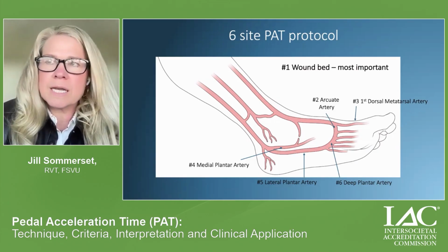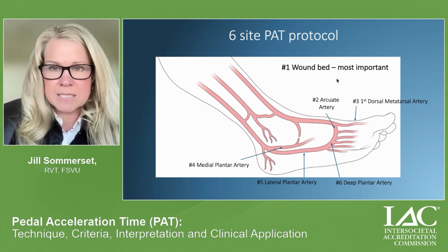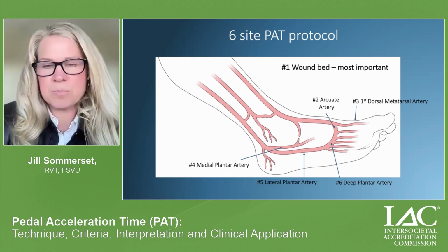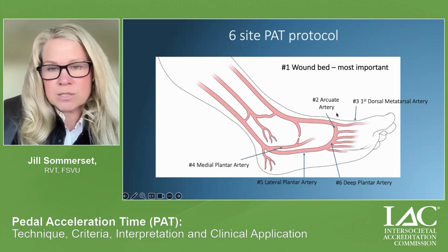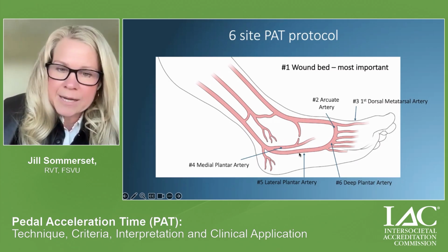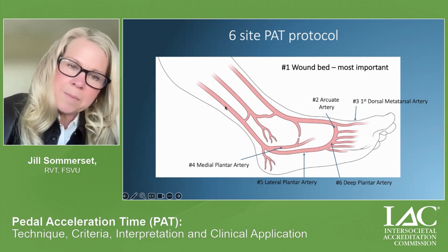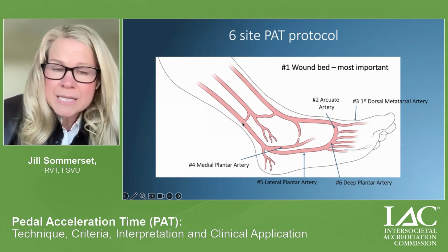But when we talk about getting PAT, the most important place to obtain a PAT is going to be at the wound bed. Once you do that, and I'll show a picture of that, we can look at the first dorsal metatarsal artery, arcuate artery, and then on the plantar circulation, we can evaluate the medial plantar, lateral plantar, and deep plantar.